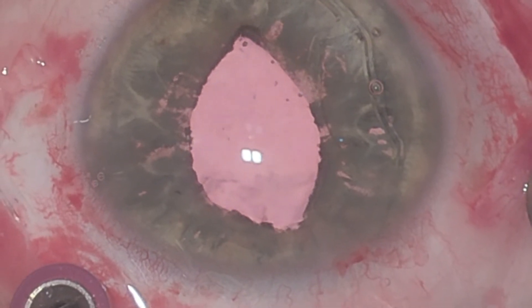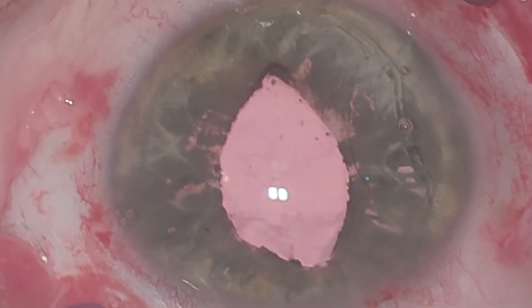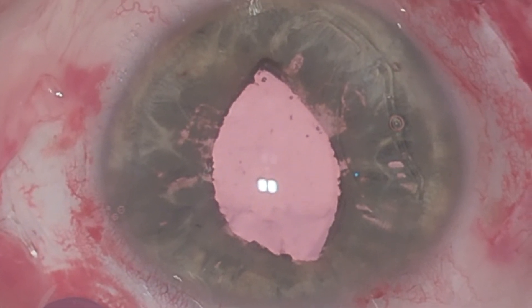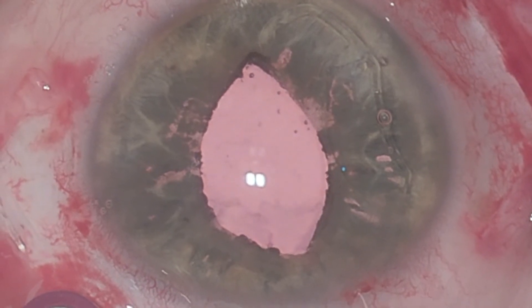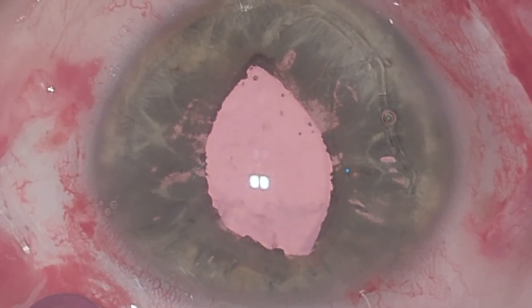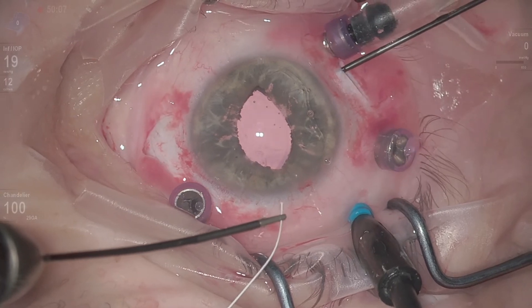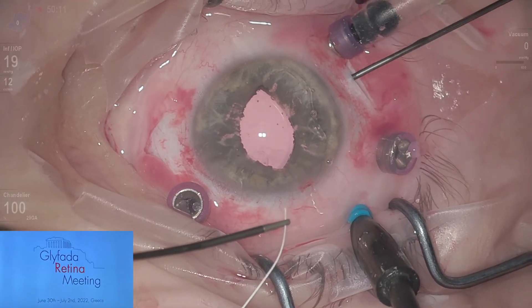The design of the lens is actually pretty good and resembles the Acreos AO and other 4-haptic IOLs. My solution would be a Gore-Tex fixation of this part of the lens. I already have my pre-made horizontal scleral pocket from the other side, and with the handshake technique I will fixate this part of the lens.